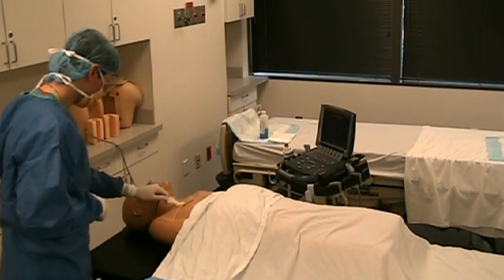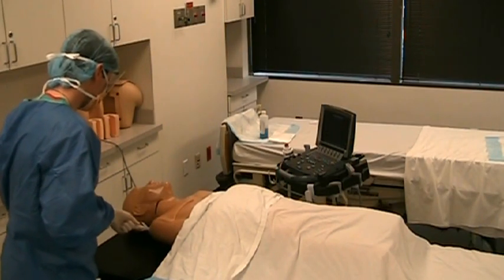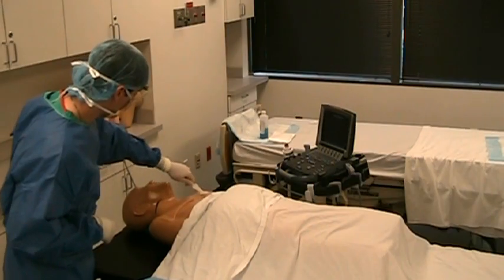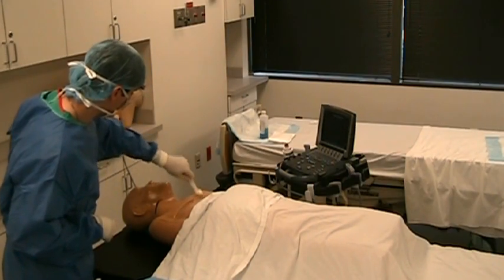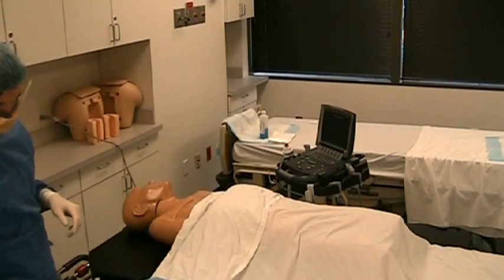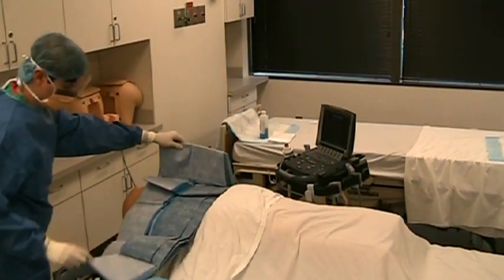The patient's neck and upper chest are sterilely prepped and draped, leaving only the neck and upper chest exposed.